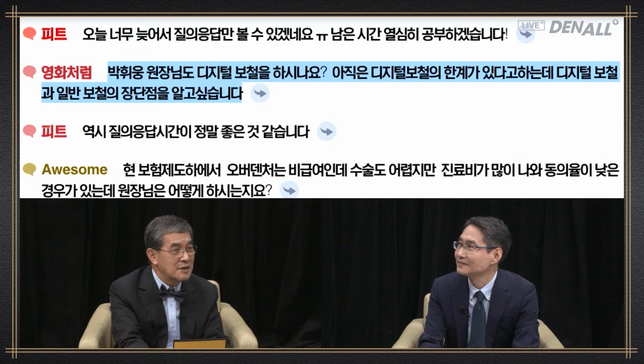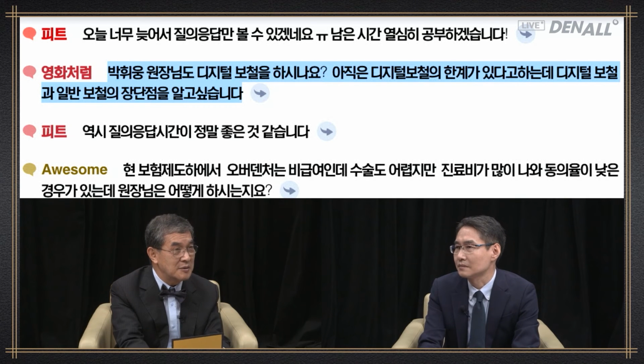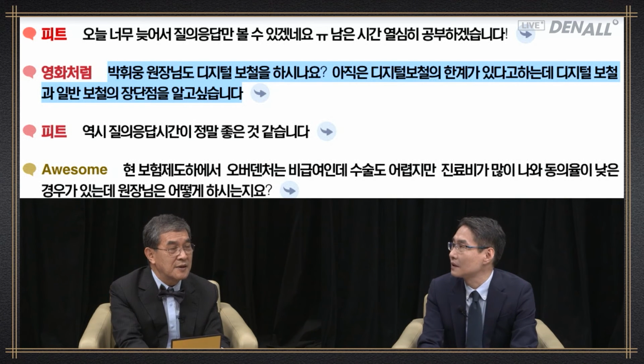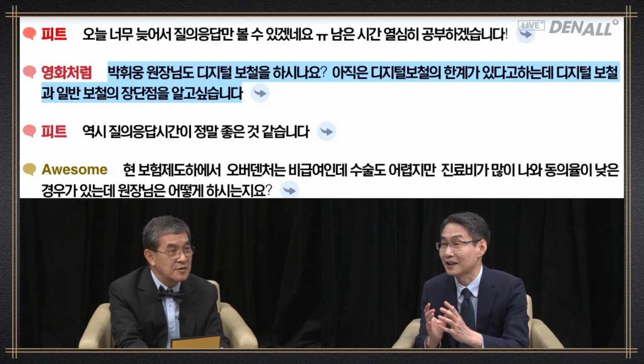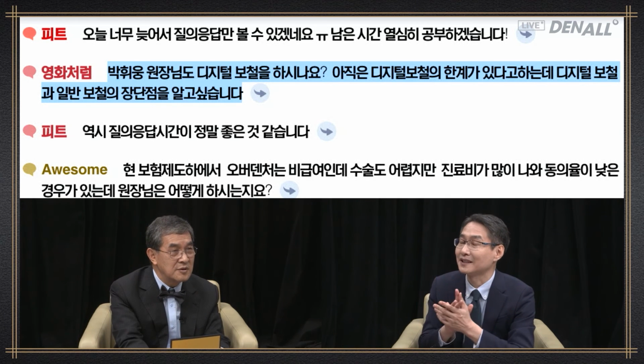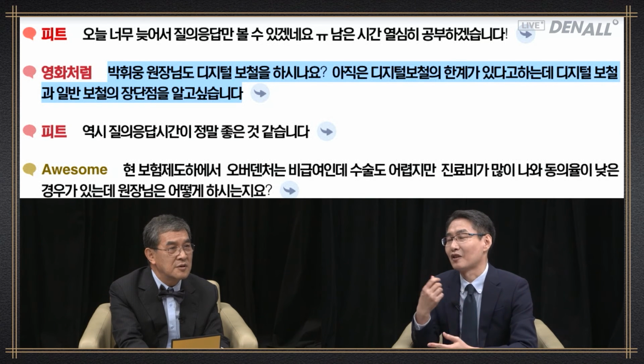However, for beginners, if you're attempting it for the first time, I believe you can utilize digital technology to reduce trial and error. In the case of a guide, with thorough planning, you are aware of where the implant position is within the patient's mouth and you have more information going in.